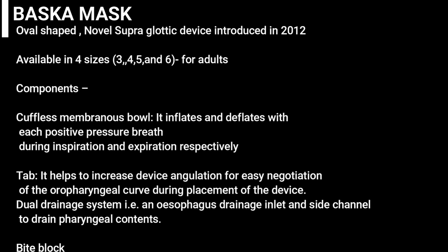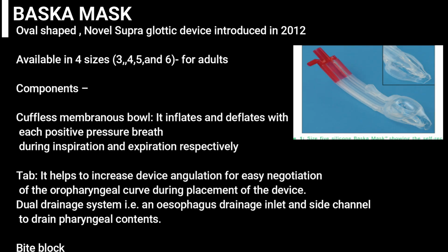It has a tab, which helps to increase device angulation for easy negotiation of the oropharyngeal curve during placement of the device. The dual drainage system, that is, an esophageal drainage inlet and a side channel to drain the pharyngeal contents. It has a bite block.